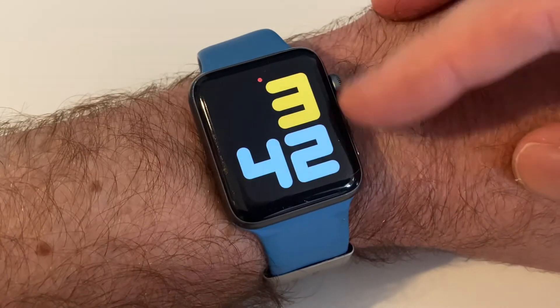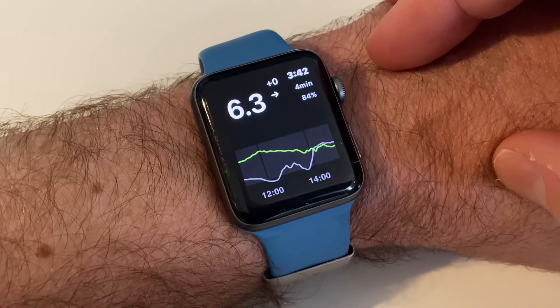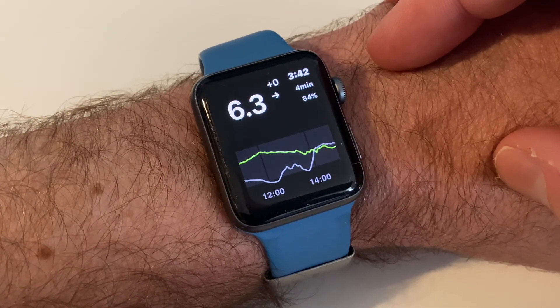So yeah, that is how you use Night Guard to have a look at your blood sugars through Night Scout.